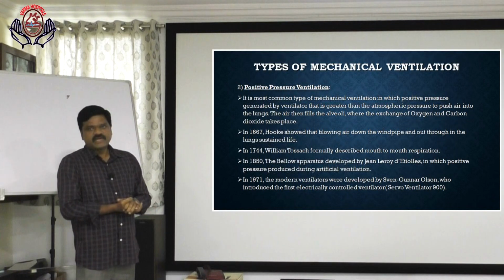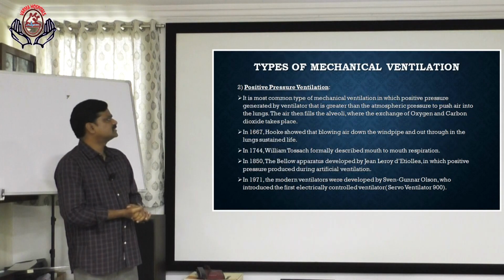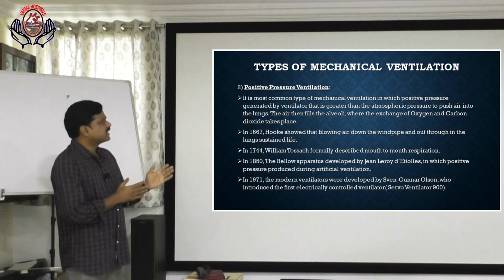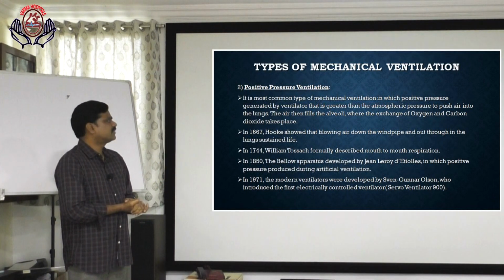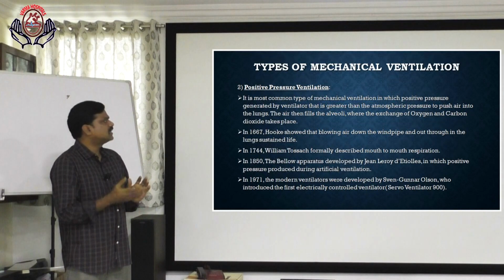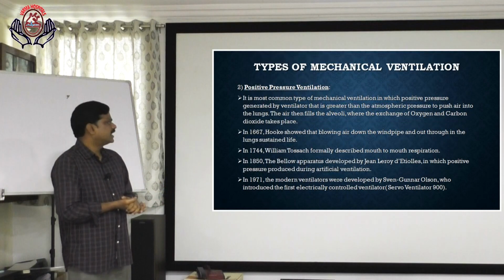Coming to positive pressure ventilation, it is the most common type of mechanical ventilation, in which positive pressure generated by the ventilator that is greater than the atmospheric pressure pushes air into the lungs. The air then fills the alveoli where the exchange of oxygen and carbon dioxide takes place.